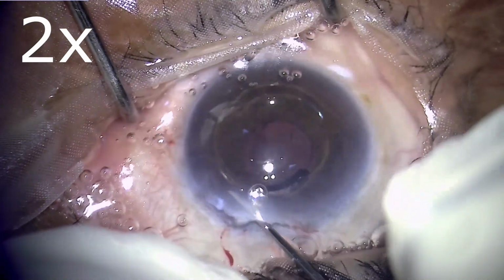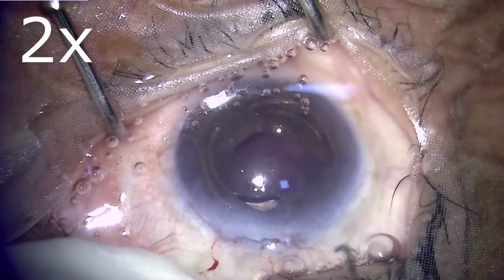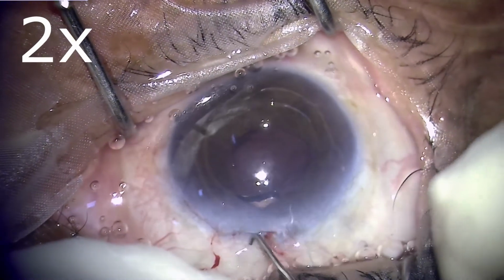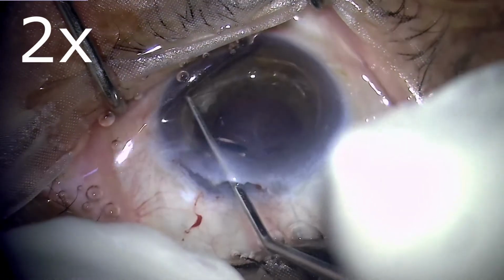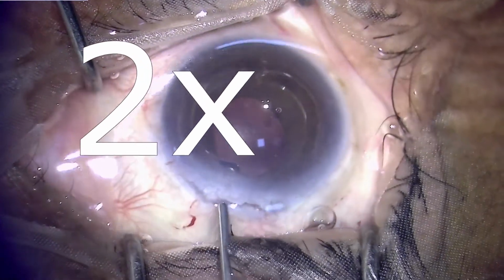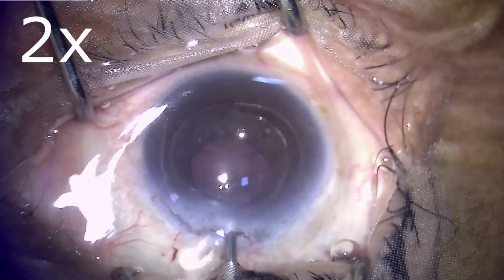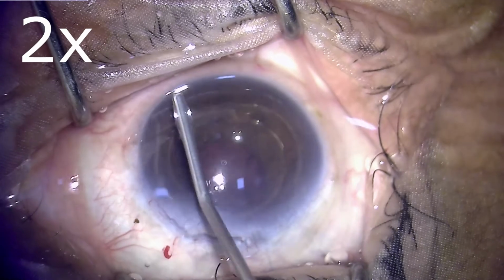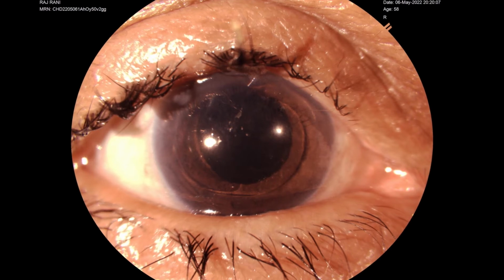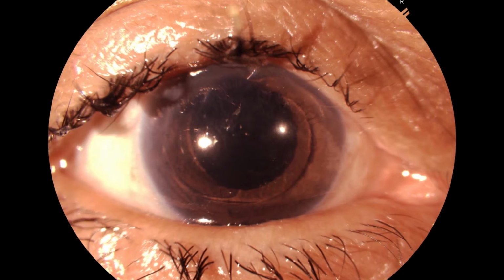So the IOL has been simply injected into the anterior chamber. The beauty of this procedure is that it is plain simple, and as I've told you, according to the KISS principle, it is simple and very stupidly simple, but it works. Now placing an anterior chamber IOL is never a hazardous surgery, because it has been proved by several studies that the rate of complications is similar to other methods of IOL implantation.